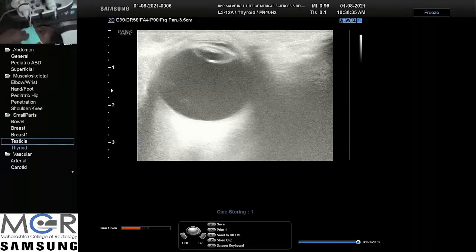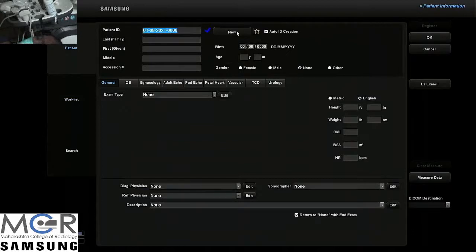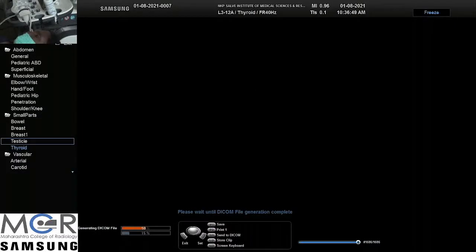Patient is a 50-year-old female who complained of diminution of vision in left eye since 10 days with sticky discharge from the left eye. The patient took symptomatic treatment for her complaints. The patient has history of bilateral cataract surgery done in the year 2007. On examination, patient was diagnosed to be a case of left eye vitritis.